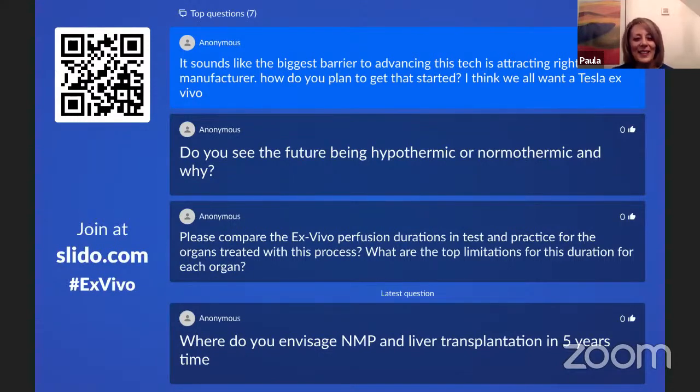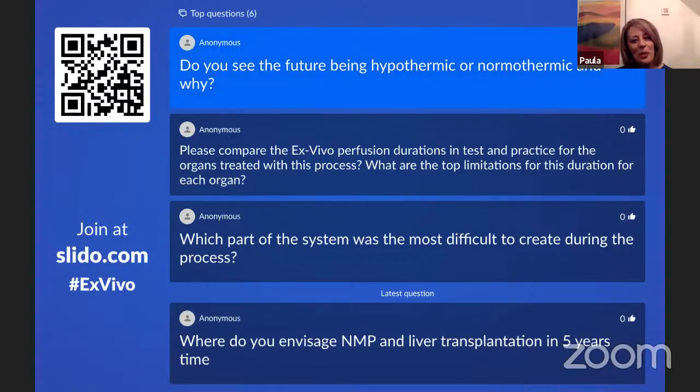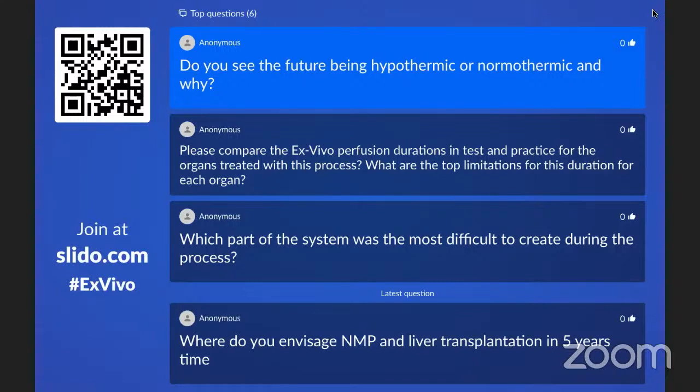Thank you for that. Do you see the future being hypothermic or normothermic, and why? I think you may have answered that question as well, but it's an important question for all of us. So at the moment, there are research groups who are heavily invested in hypothermic perfusion. Others are normothermic. Hypothermic perfusion is easier, cheaper, and safer. If the machine breaks down and the pump stops, the liver or the kidney is still cold. Then you have the same preservation like before. If the normothermic machine breaks down, the organ is lost. You cannot keep any liver or kidney warm without blood flow for more than a few minutes.